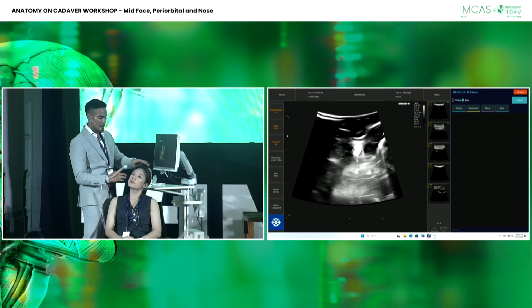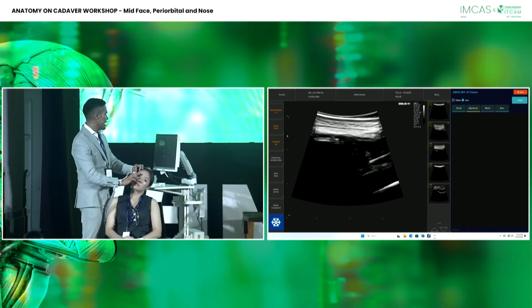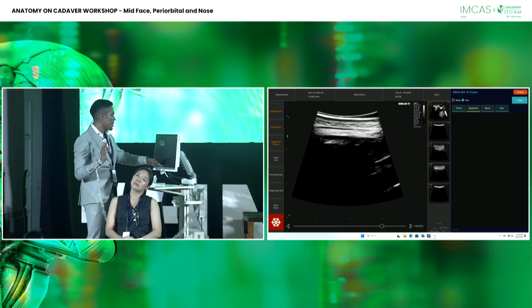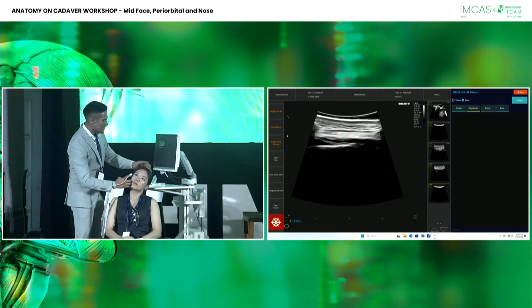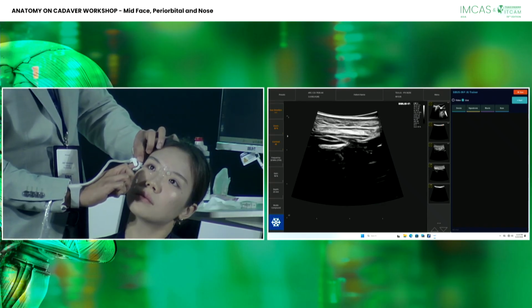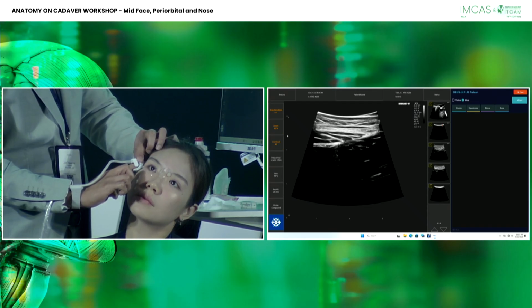We just got an acceptance for our publication about this matter. And let me guide you through the following thing. I'm going to stop the image, go back in time, and I will walk you through the anatomy of this matter. So here is the bone. Here is the deep fat of the zygomatic arch. I am placing my probe. If you see how I am doing it on the model, I am really going from the lateral cheek downwards. Here is the temple. So these two anatomical units are connected with each other.